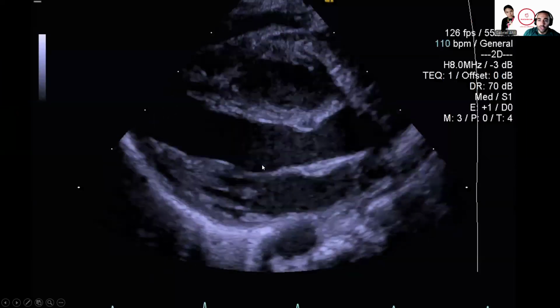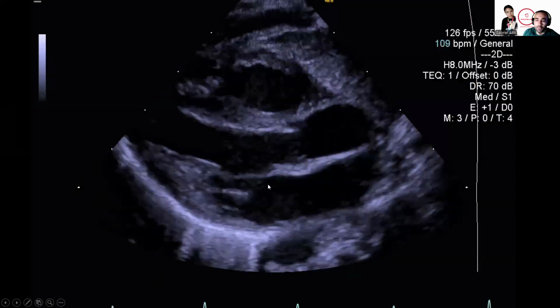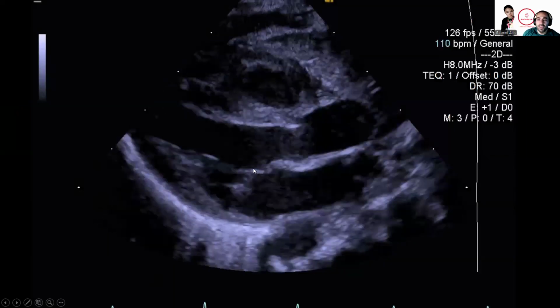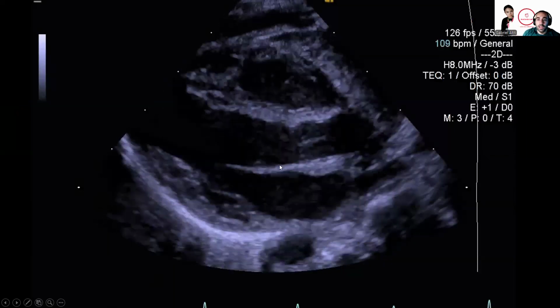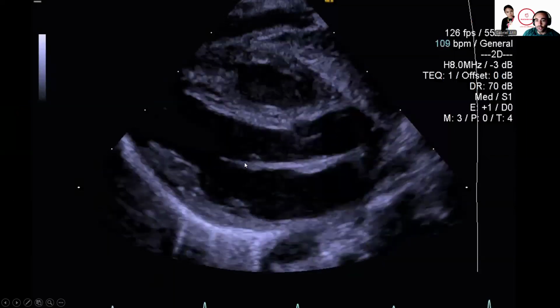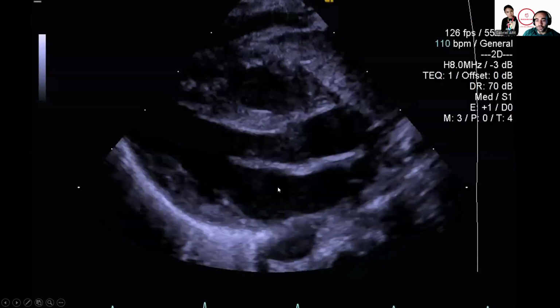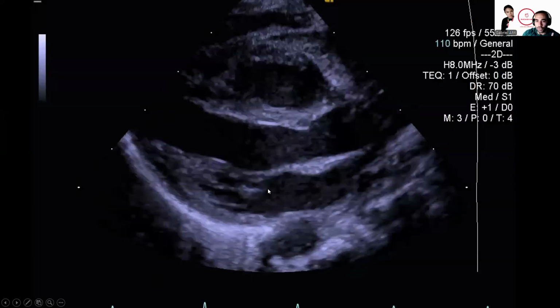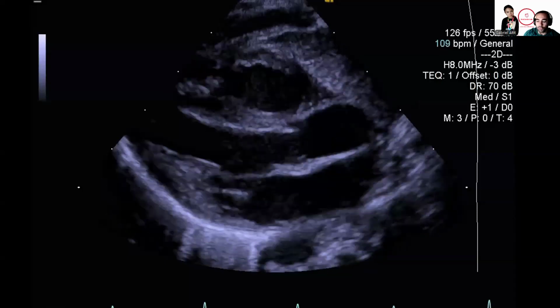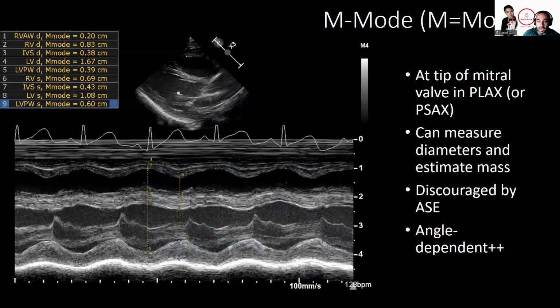One other very common element that people will look at in more of the pediatric emergency medicine cardiac POCUS field is something called the E-point separation. A very vigorous left ventricle will have a tendency to have the anterior mitral valve leaflet get closer to the septal wall during contraction. Not too close though, because if it's touching and blocking the outflow tract, we call this systolic anterior motion of the mitral valve, which is not a good thing, and it's more of an advanced application.